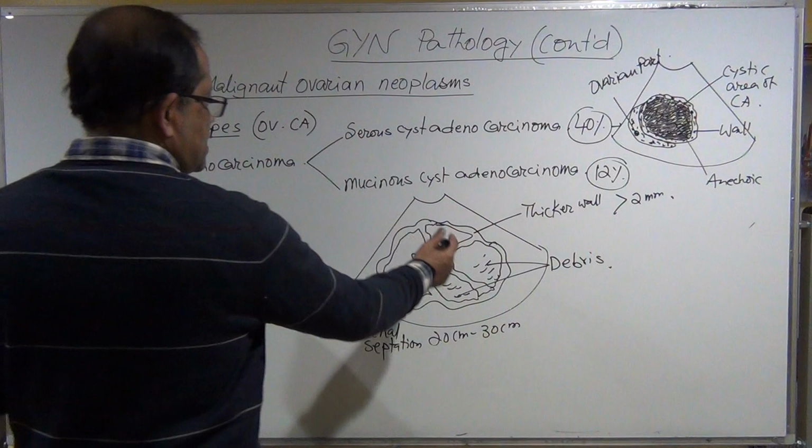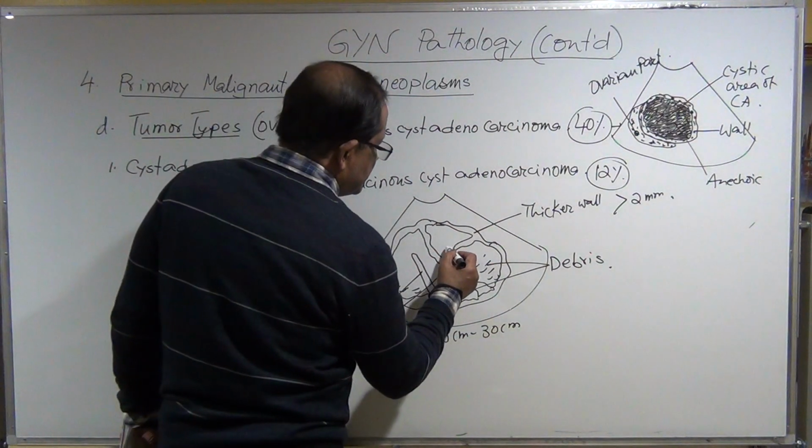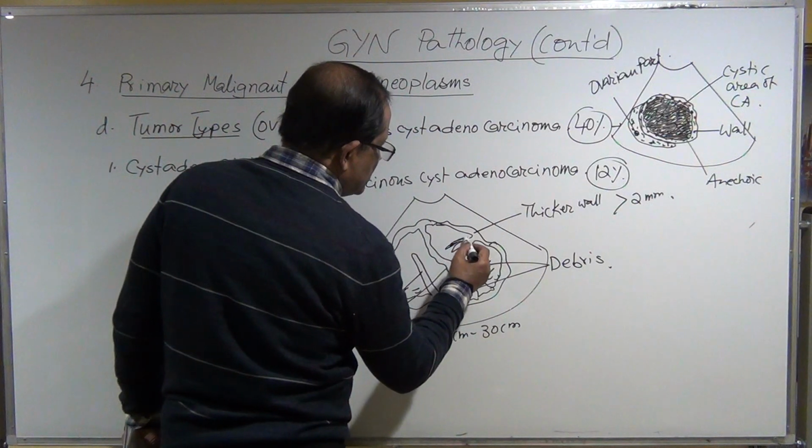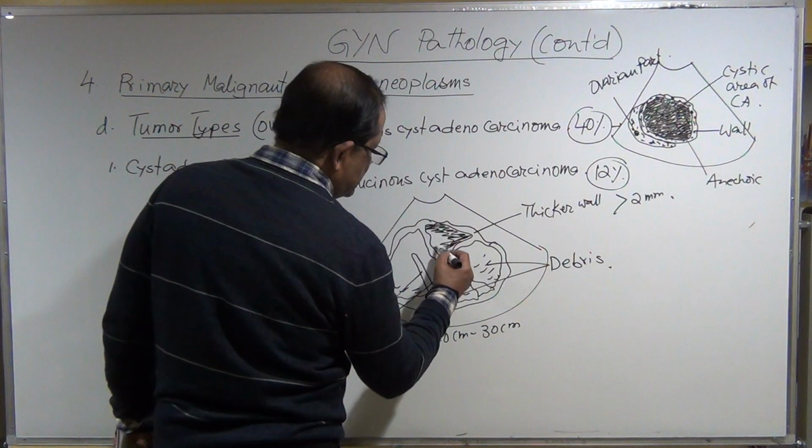Okay, and multiple septation, internal septation, and it is filled with fluid, and the dirty fluid.